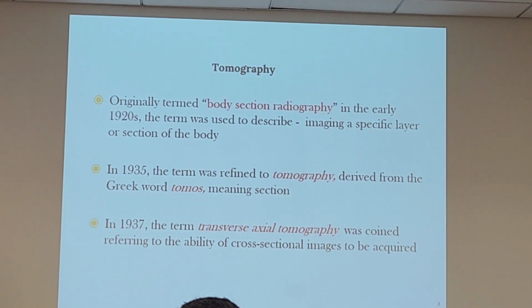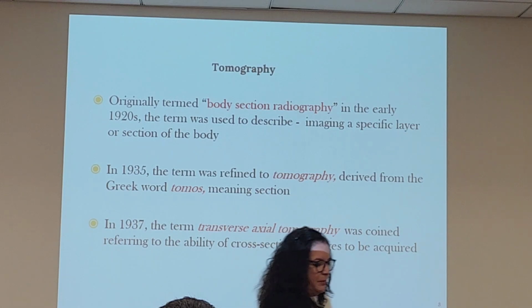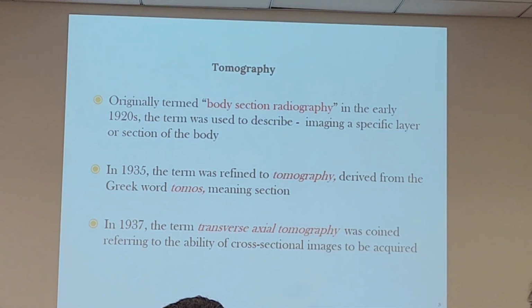But can anybody tell me, what's the number one image display? Like, how is the body displayed? Was it coronal, sagittal, or transverse, axial? In a CT? Very good. It's all axial. So you may want to take a note of that. Everything that is acquired through CT is always going to be axial. Reconstruction goes back into coronal and sagittal.